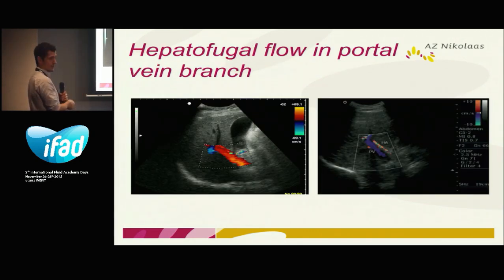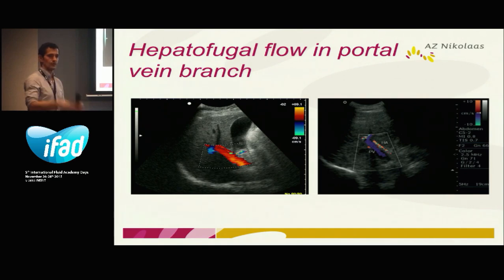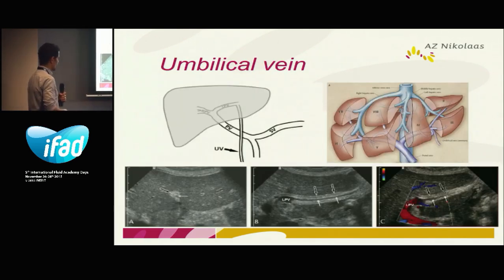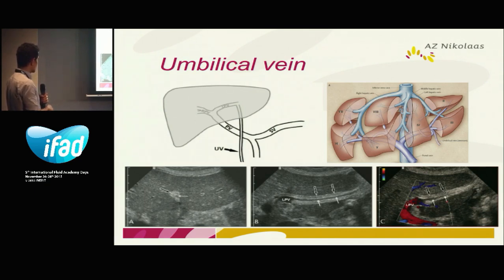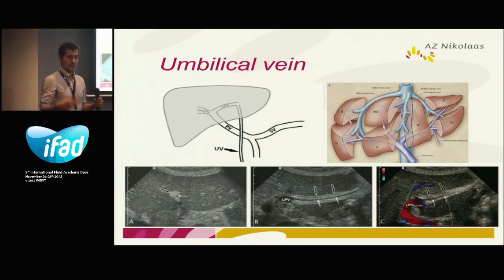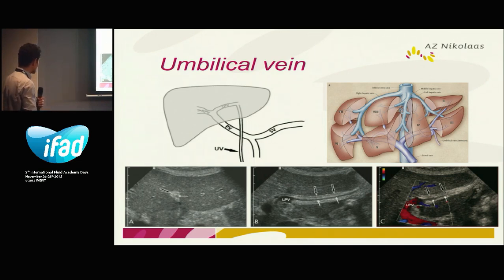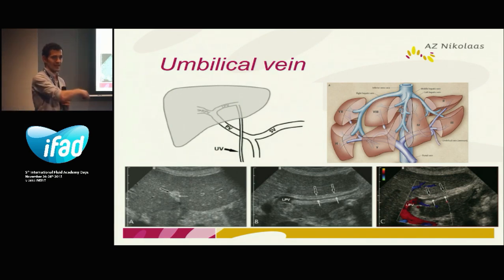Normally the flow goes to your liver, but in severe liver disease the flow goes away from your liver — hepatofugal, meaning the flow goes away. If cirrhosis is very severe, you can appreciate repermeabilization of the umbilical vein, which leaves from the left portal vein. Normally after birth it disappears, but in portal hypertension it can reappear. Here we see the ligamentum teres with repermeabilization of the umbilical vein as a sign of portal hypertension.